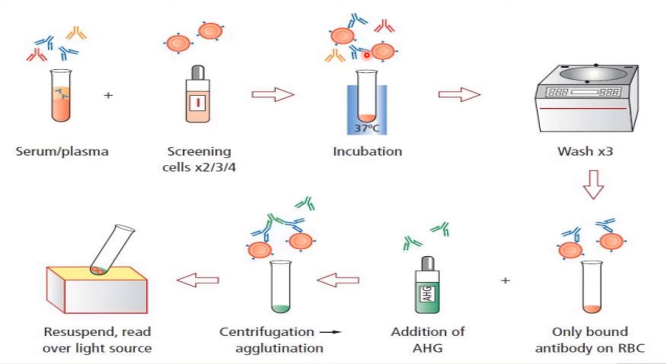The RBCs get attached to the antibodies, that is, sensitization occurs. After 45 minutes, look for agglutination. If there is no agglutination, centrifuge at 1500 rpm for 2 minutes. Discard the supernatant. Now washing is done. As I have told earlier, in the blood bank we do the washing procedure: to the button of cells or sediment you get, you add normal saline, mix the content properly and centrifuge again.